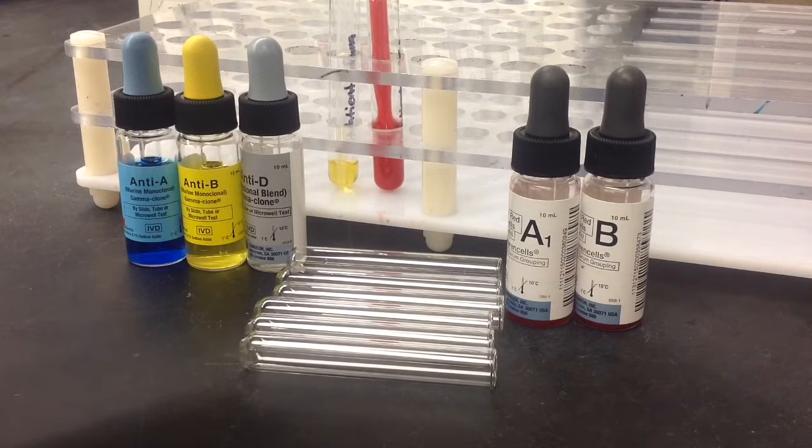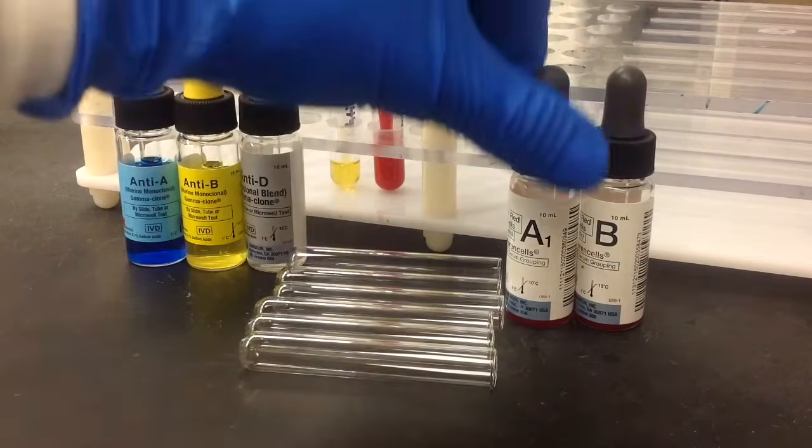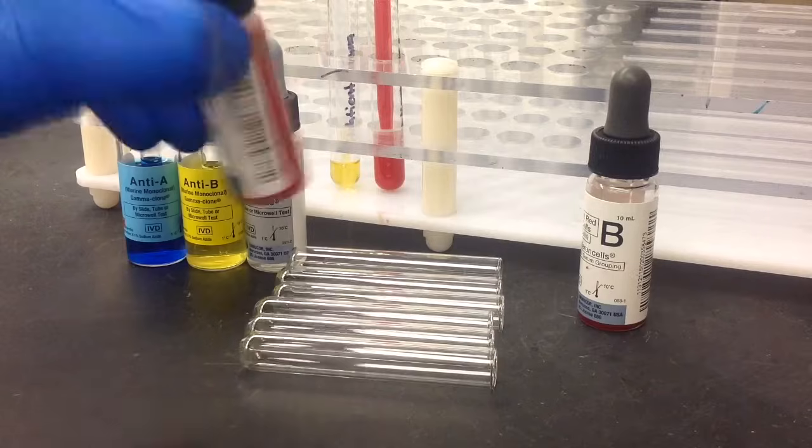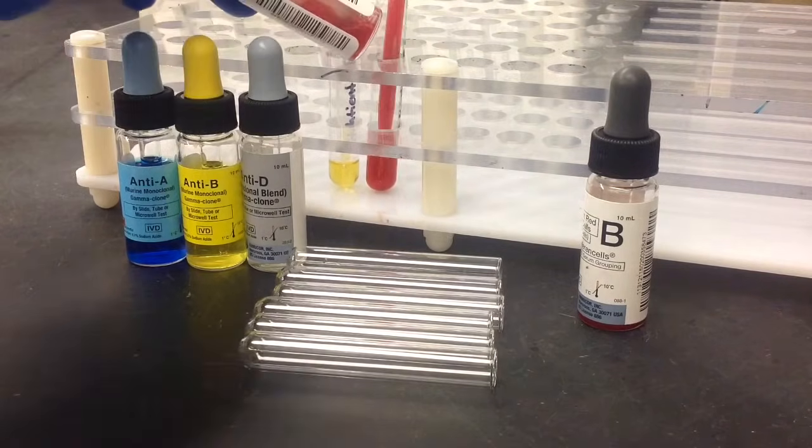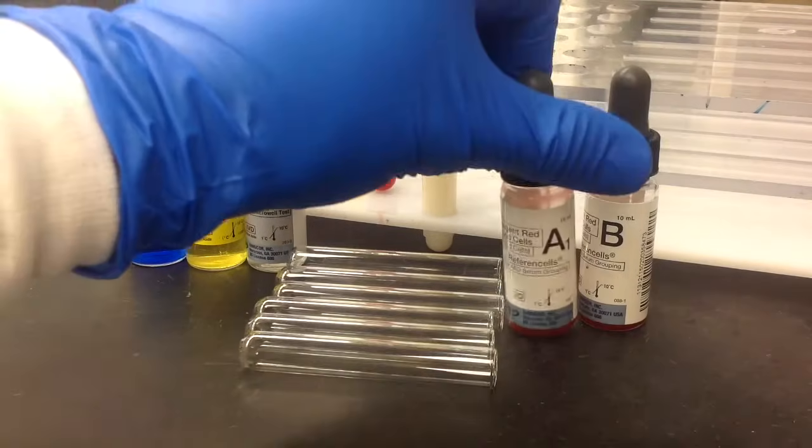And I'm shooting for approximately 3%, and I'm using physiological saline for this. If you're not exactly sure what 3% should look like, you can use your reagent red cells to make a comparison. And the reagent red cells should be about 2% to 4%, so if they look the same, you're pretty close.